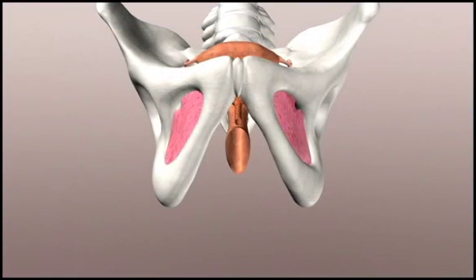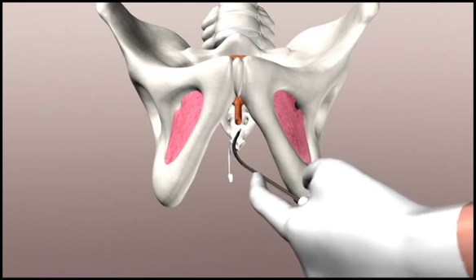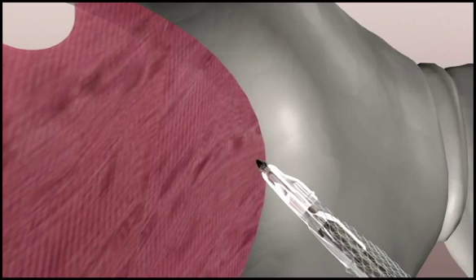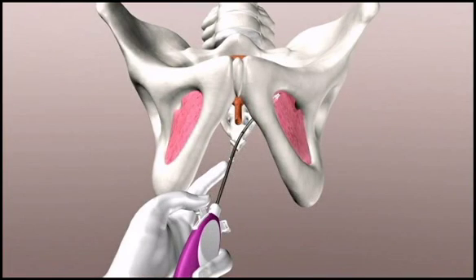Insert the needle and aim toward the medial edge of the obturator foramen approximately 45 degrees off the horizontal plane. Track the needle along the posterior surface of the ischiopubic ramus. Once you are beyond the ischiopubic ramus, pivot the handle and advance the needle into the obturator internus muscle until the midline mark on the mesh is approximately at the midline position under the urethra.